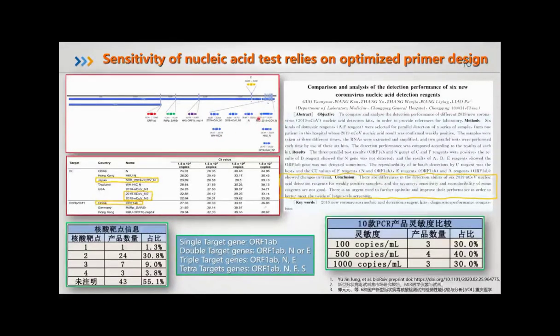this primer set. They find that in the case of targeting RdRp region, this region, the China ORF1ab set might be the most sensitive compared to the others. So the US N2, N3, and Japan N2D, these sets may be recommended for sensitive qRT-PCR assay for N region.